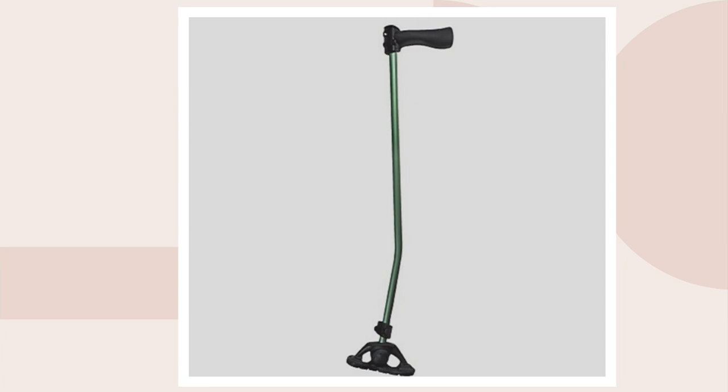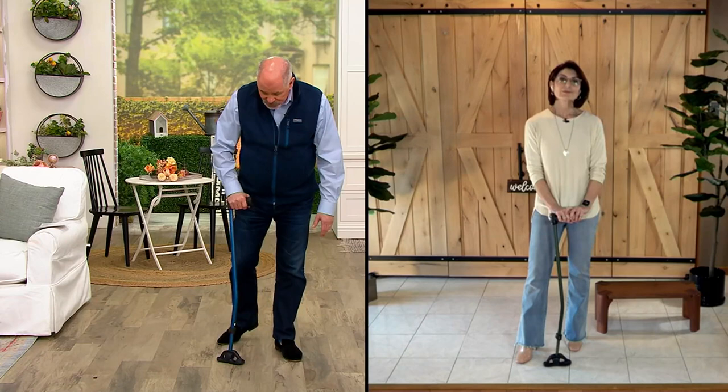If you saw last hour, you saw Denise Repco — she is also the representative for Dynamo Canes. I like that this gives you a much bigger handle. It's a much more comfortable design and you can rely on that stability.